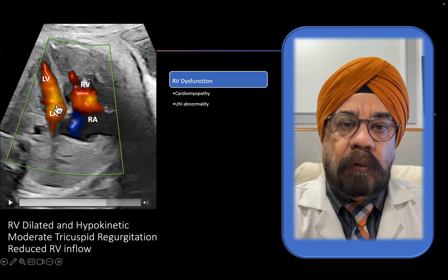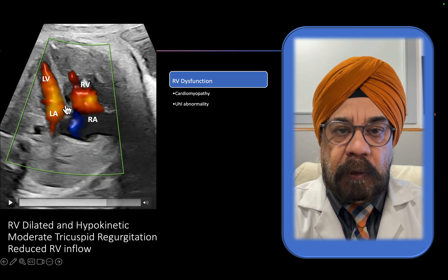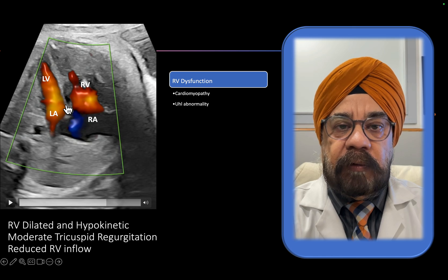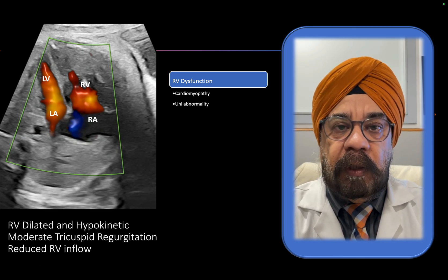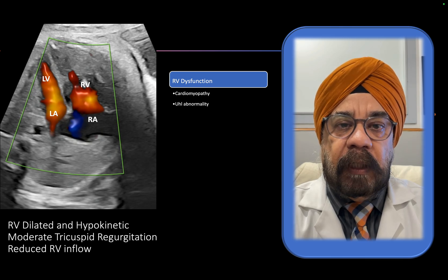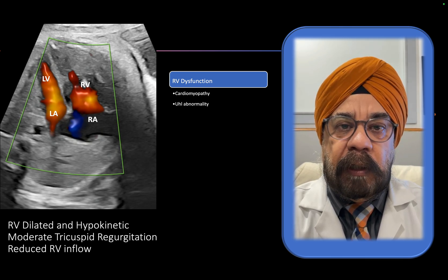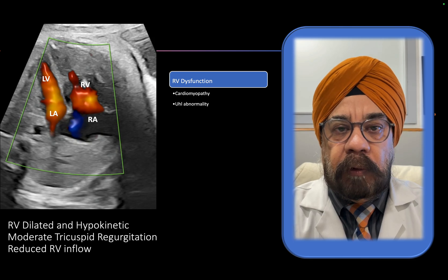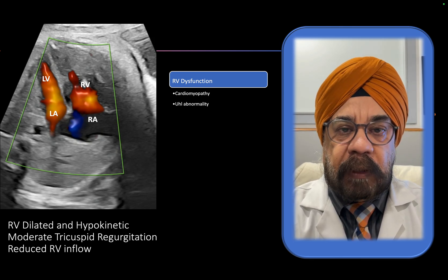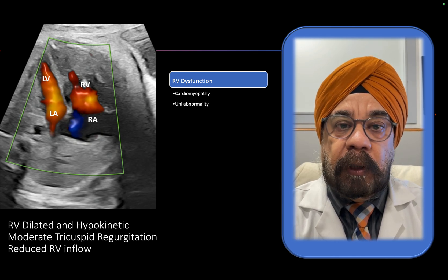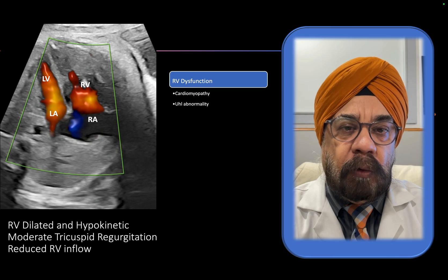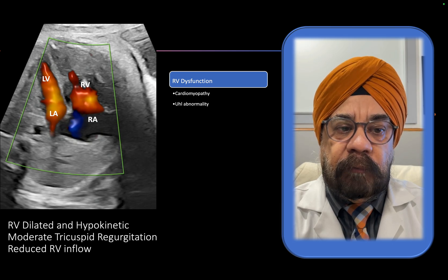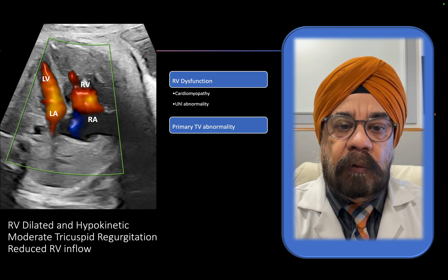Moreover, in the fetus you generally do not get single ventricle involvement because the heart is encased in a cage of non-aerated, solid lungs, so there is a lot of interventricular interdependence. If one ventricle dysfunctions, it generally tends to affect the other ventricle in systole or diastole. So this doesn't appear to be a good diagnostic explanation.